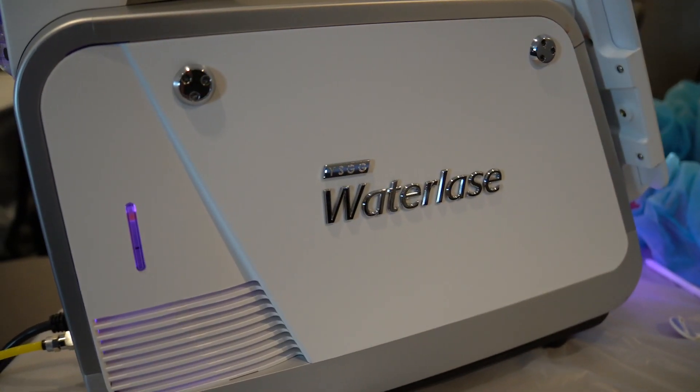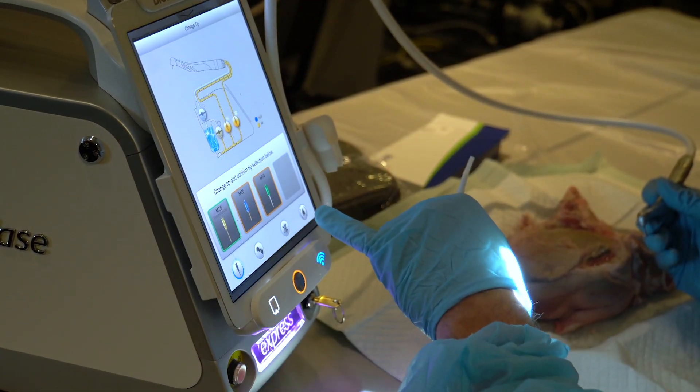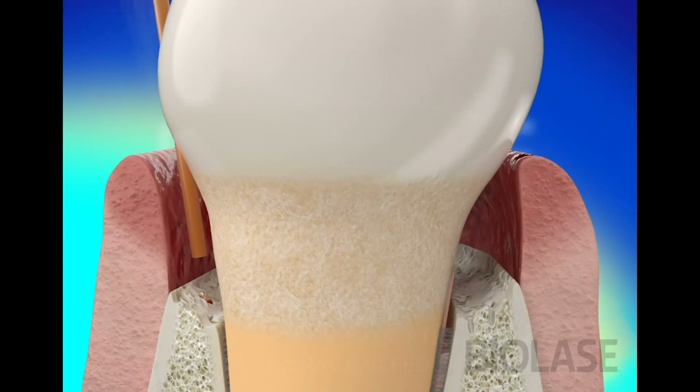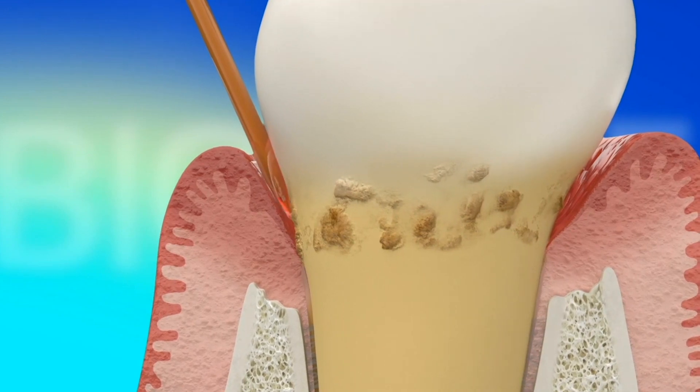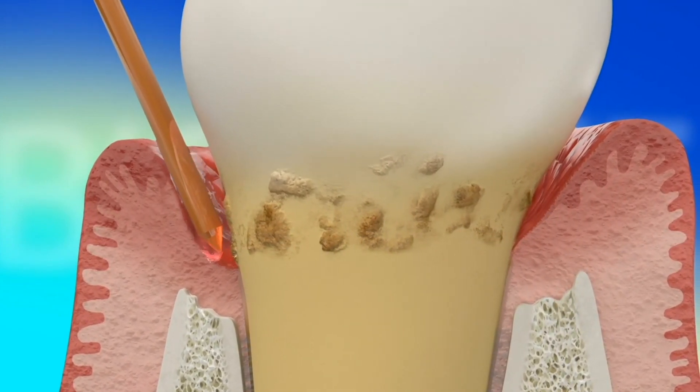I love the water laser from what I've seen so far, and I'm sure we're going to be integrating it. The great thing for me about the water laser is the fact that it's an erbium laser, which we don't presently have. Now we have this erbium laser that can also do work on bone and hard tissue, not just soft tissue. So it's more of a jack-of-all-trades when it comes to perio, compared to some of the other lasers which are primarily just soft tissue or just hard tissue.